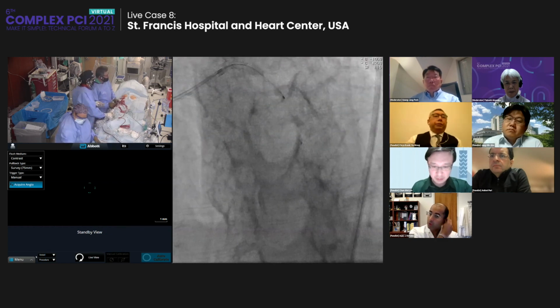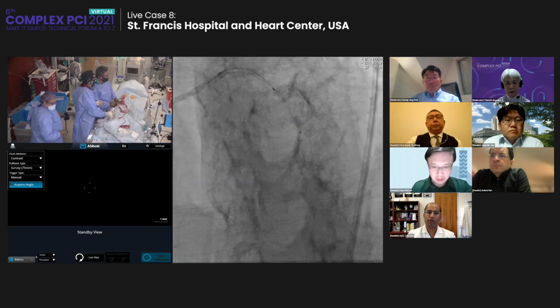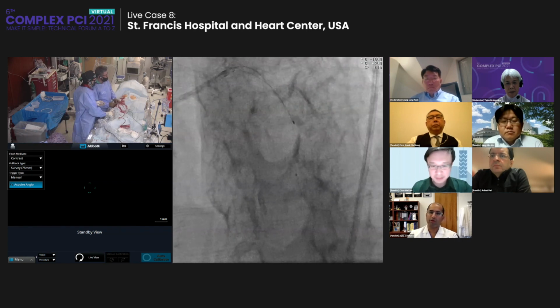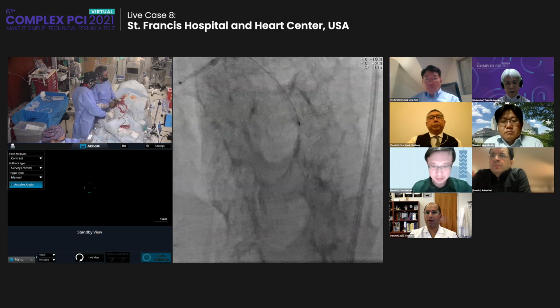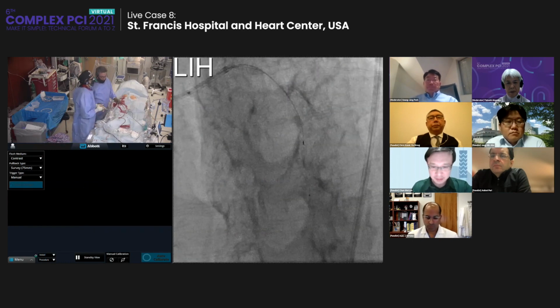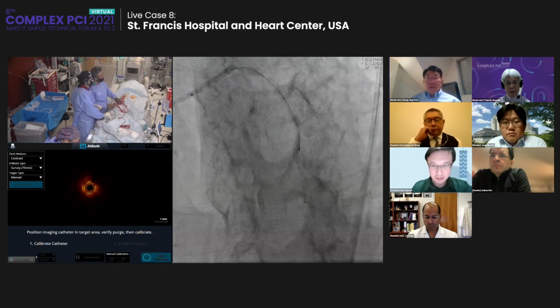The other thing with the wiggle wire, which is useful, is that oftentimes you get caught on spicules. And so just gentle negative tension on the wire, moving it 1 or 2 millimeters. I move it back and up. Exactly, that's what I'm doing right now. I'm jockeying it back and forth to change the wiggle, a different orientation. That's great for in-stent as well.